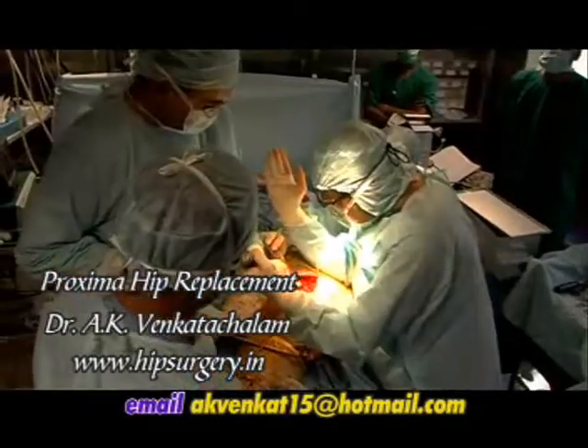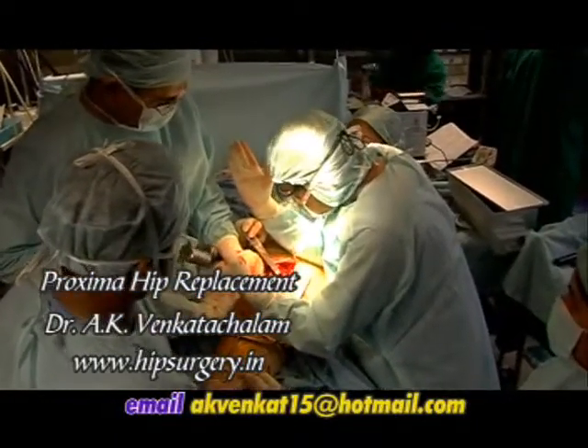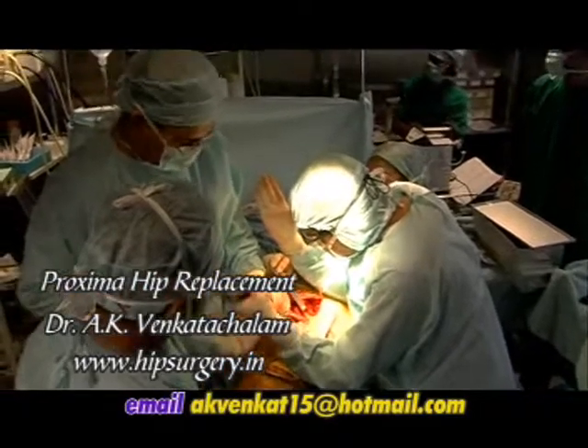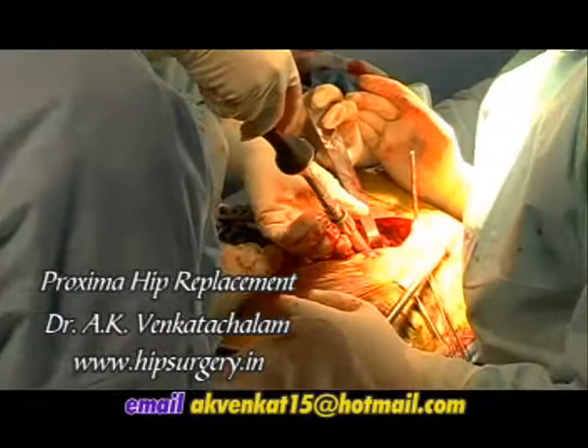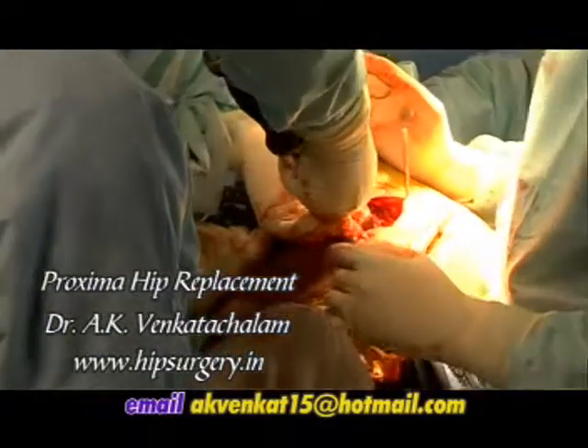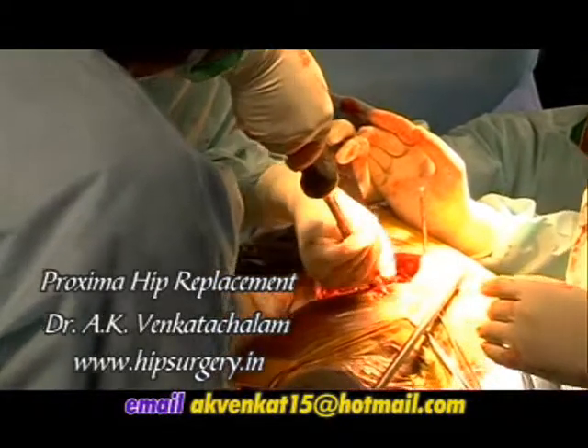When the surgeon is satisfied with the position and snug fit of the trial cup, the real implant is placed and hammered to the correct depth. The cup inserter is removed. The real cup is bigger than the last trial cup by 1 mm.